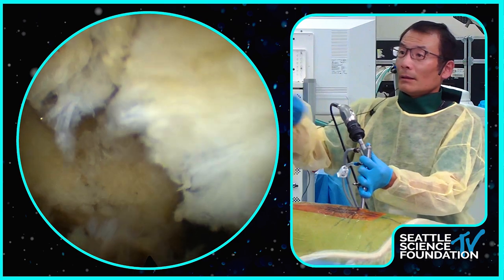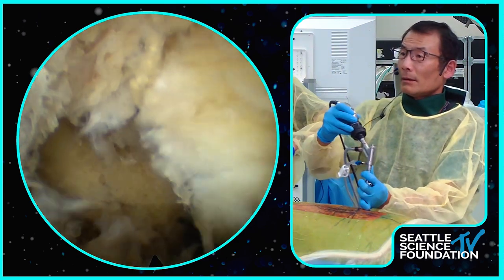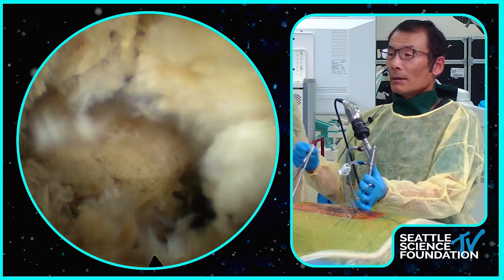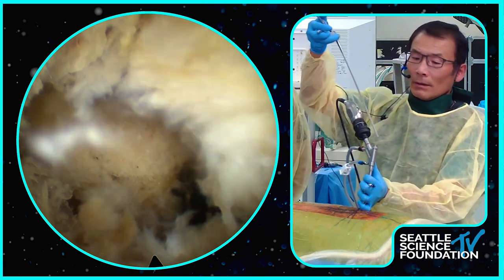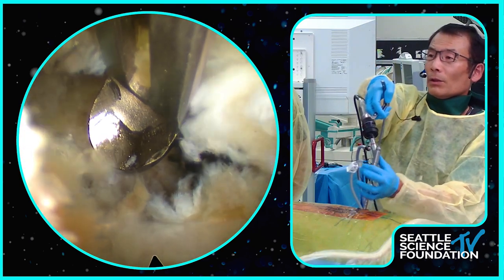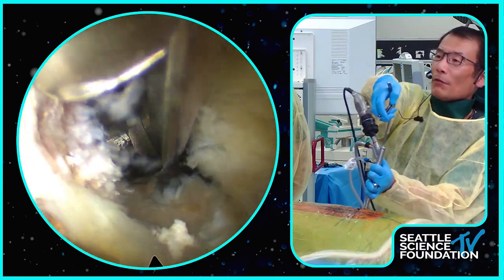Shen, a quick question for you. With a standard interlaminar approach, we're in the interlaminar window, but you started lateral to the S1 pedicle. So in this case, it was lateral to the L5 pedicle when you started. Right. Exactly. This is the L4-5 level.